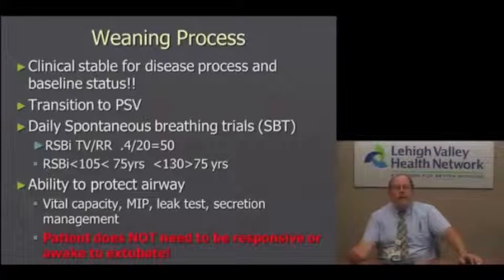Now, before I get into the actual modes of ventilation, I just want to talk a little bit about the weaning process, because, again, for the majority of patients you really won't be weaning, you'll be transferring. But I think it's important to understand what our goals of mechanical ventilation are, in the sense of trying to facilitate liberation. What's very important is that the patient is clinically stable for their disease process and their baseline status.